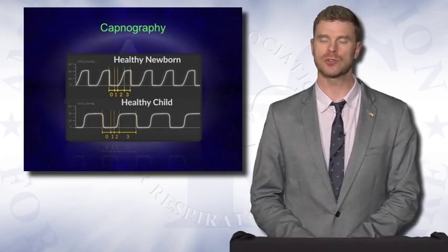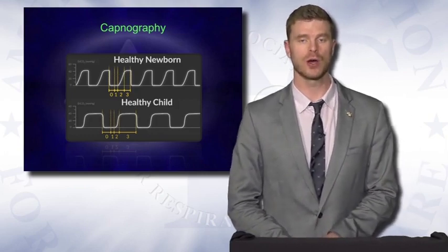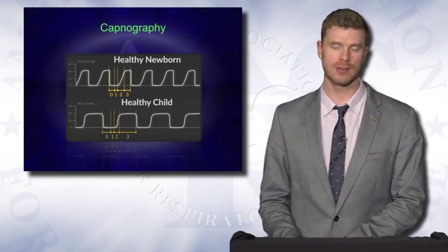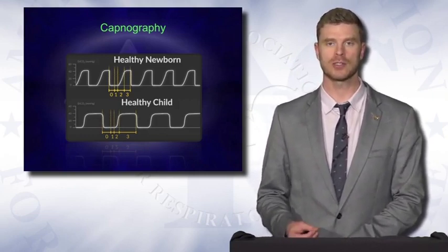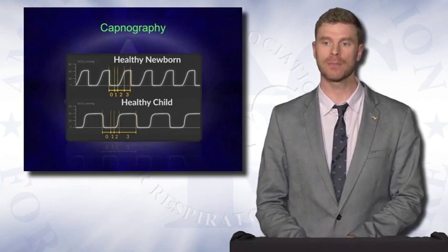In phase 2, let's look at the healthy child. We see a marked or sharp increase or rise in the CO2 concentration over time. And this is the mixing phase or the transition phase. What we're going to be monitoring in our patient basically are those conducting airways. And we're starting to get down to the alveolar gas where we see really high concentrations of CO2.